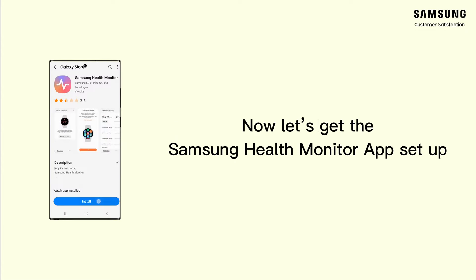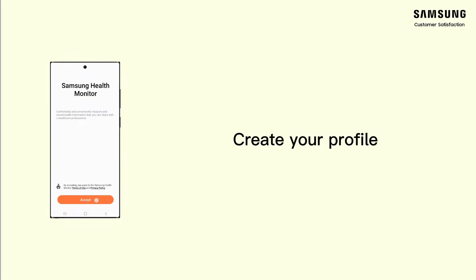Now let's get the Samsung Health Monitor app set up. Create your profile.